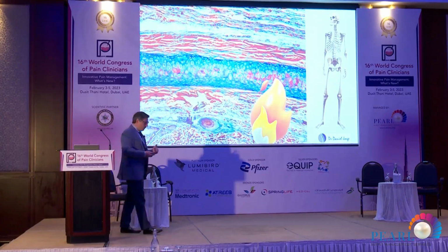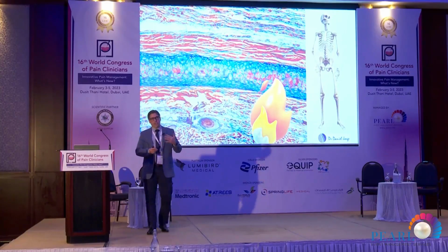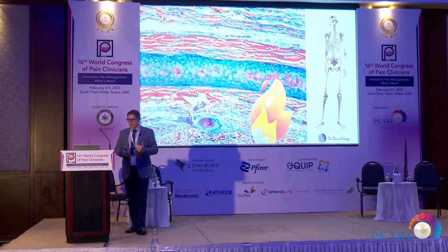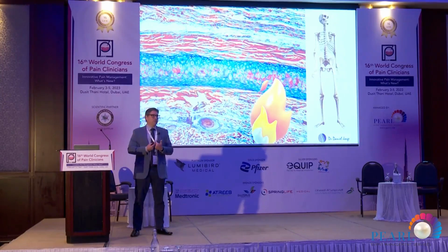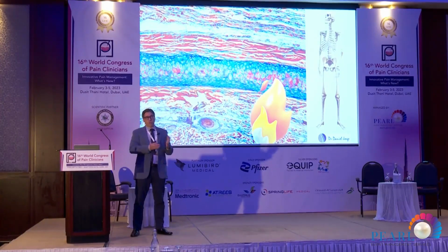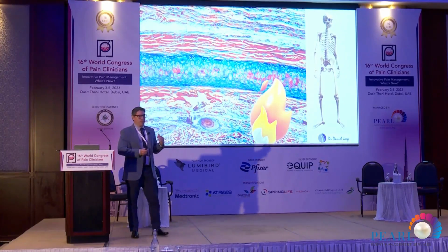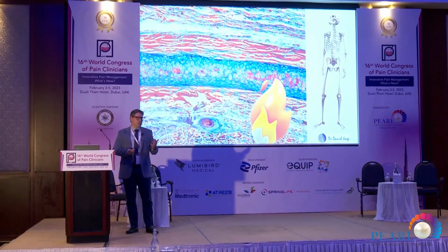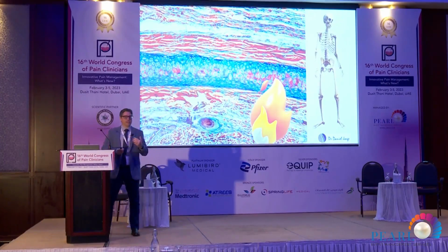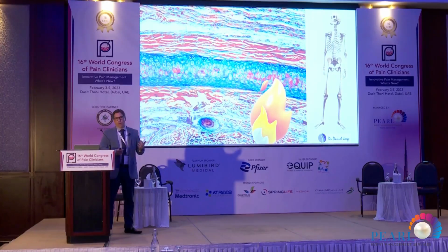But with the continuous radio frequency, we actually have some limitations about the use, because, especially as an orthopedist, I have to think about the chondral tissue, the cartilage. With the heat treatments, we cannot treat those joints. The cartilage cannot stand heat, and neither can motor neurons or mixed ones.